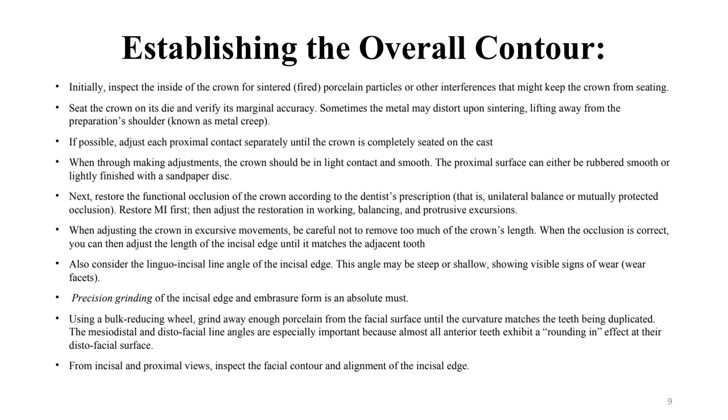Establishing the overall contour. Again, we talk about this, what we're looking for in terms of the contour and especially the function. We start by talking about the function and then we move towards aesthetics, right? If a patient has characterization, texture, right?